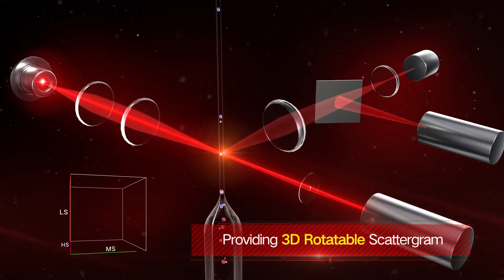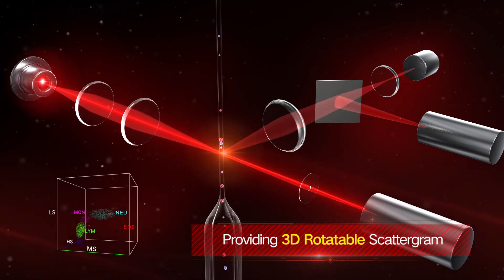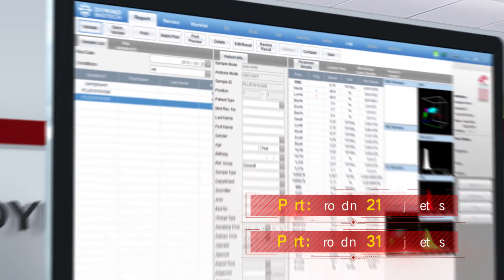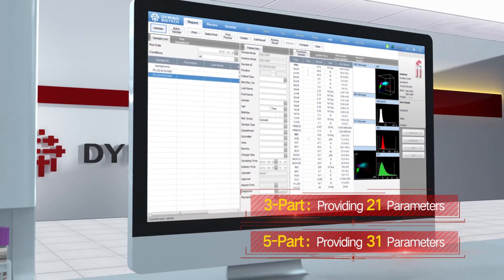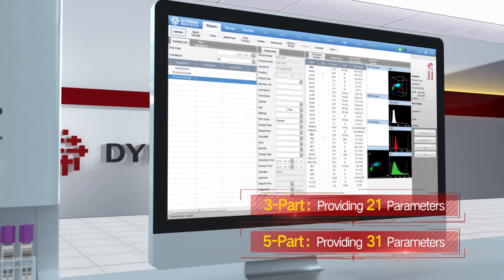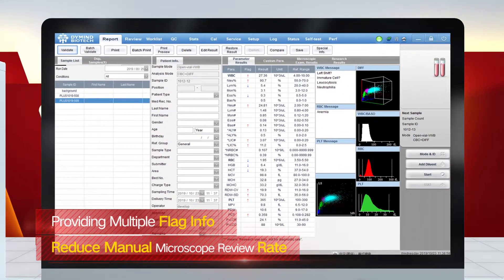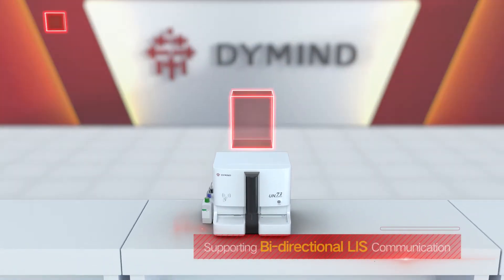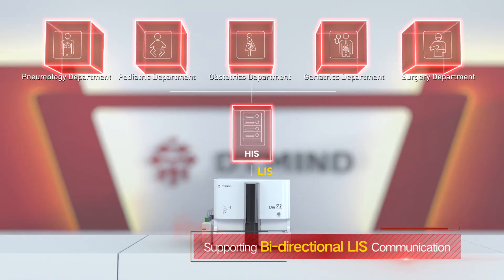Three-angle laser scattering provides a 3D rotatable scattergram for more accurate WBC five-part differentiation results. The system offers 21 parameters for three-part and 31 parameters for five-part. Multiple flag indicators help users reduce the rate of microscope review, and bidirectional LIS connectivity enables fast data interchange.